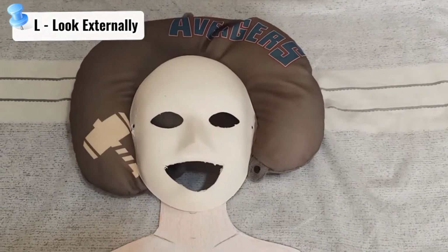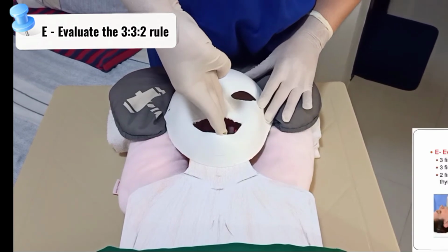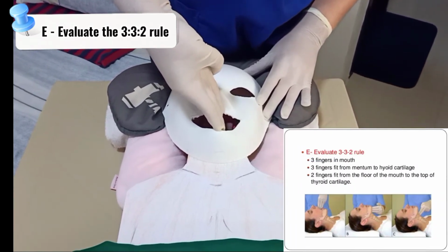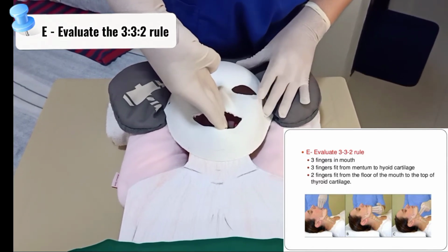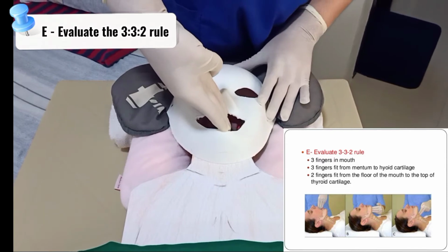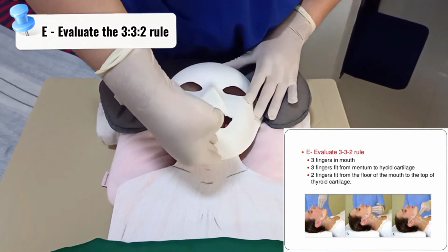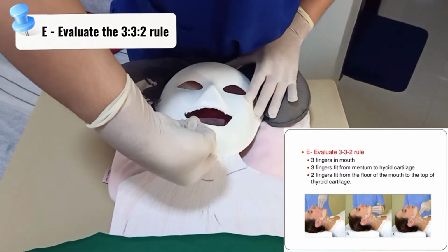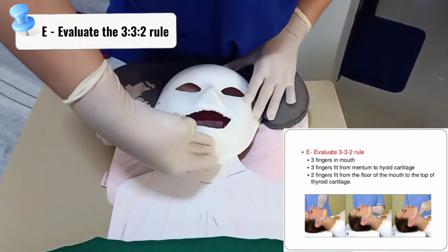For the 3-3-2 rule, the distance between the upper and lower incisors should measure at least 3 finger breadths, which indicates adequate mouth opening. Hence, we will be able to access a sufficient glottic view. Another 3 finger breadths for the distance between the hyoid bone and the lower border of the mentum, which means that the patient's mandible is large enough to accommodate a normal-sized tongue. Hence, we have the ability to deflect the tongue with the laryngoscope.